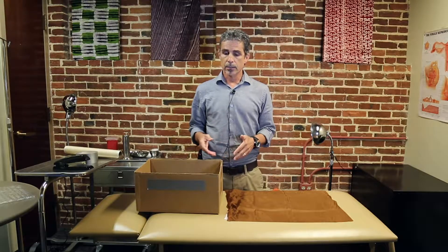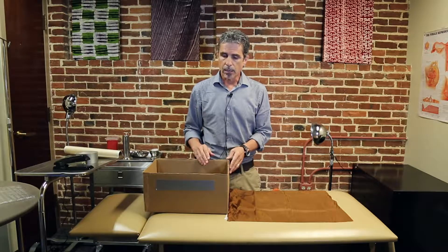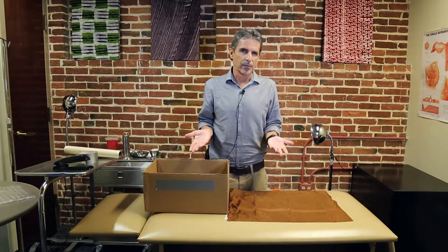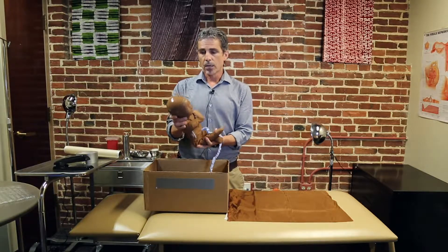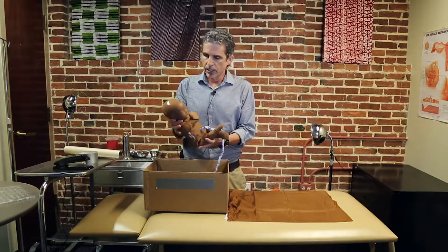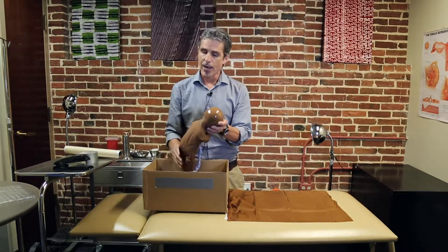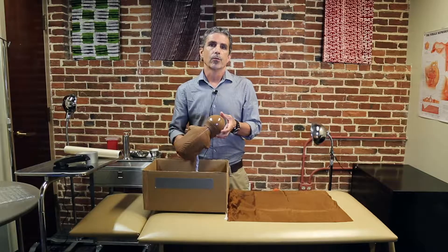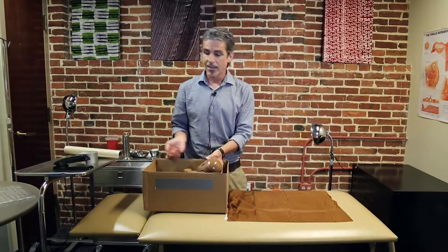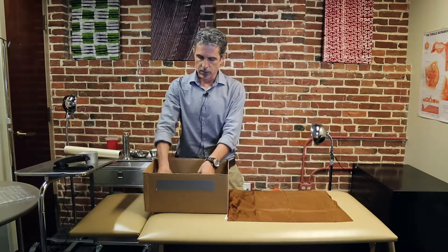The first thing you'll need is a uterus. You can use a cardboard box or a plastic bucket for that purpose — it just needs to have a depth that will hold a fetus and the placenta, and an appropriate width to mimic the uterus. For the fetus, you can use one from the Mama Natalie or Neonatalie models, along with the placenta. When doing a simulation, remember to know which way the head is facing — whether you're practicing vertex or cephalic delivery or breech delivery, knowing the position of the head or legs is important.